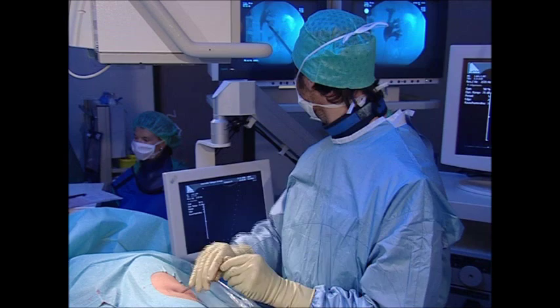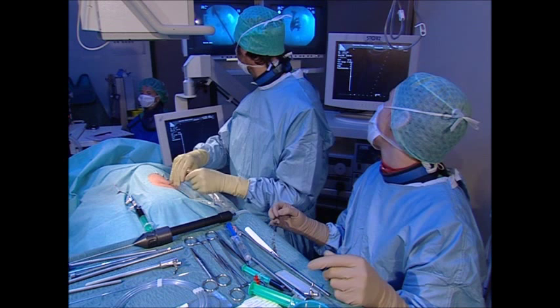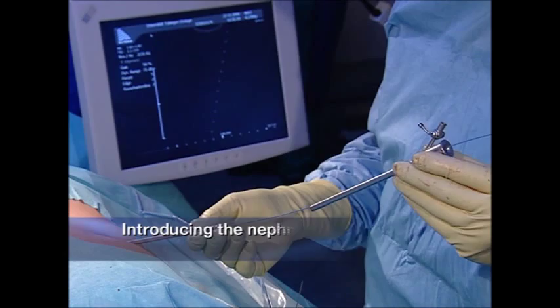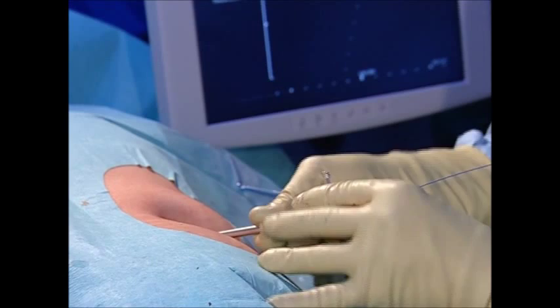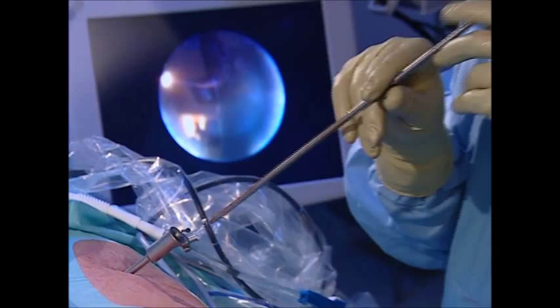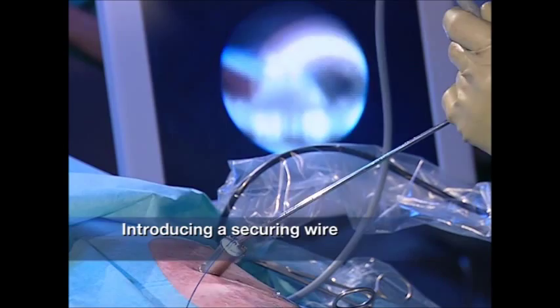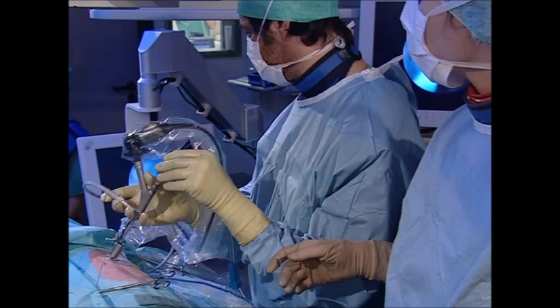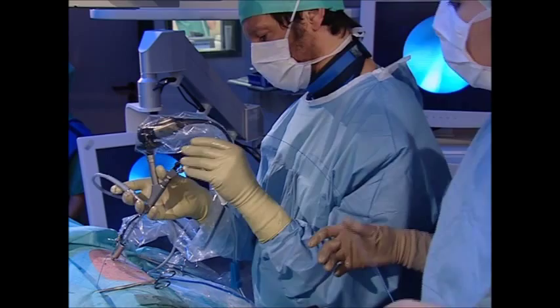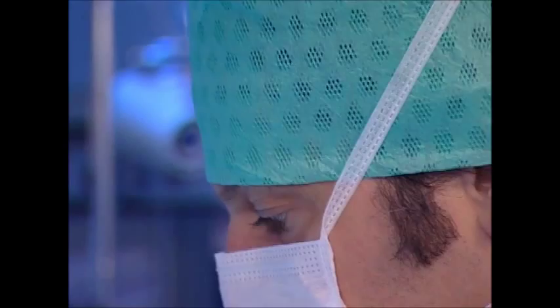The correct position of the bougie in the renal collecting system is confirmed by blue contrast medium which flows out of the second channel. The nephroscopy sheath is screwed over the manually secured metal bougie. The bougie is then removed and the guide wire secured. After switching on the endoscopy monitor, the nephroscope is inserted into the renal collecting system along the guide wire and another safety wire is introduced, positioned either in the superior caliceal group or in the ureter.